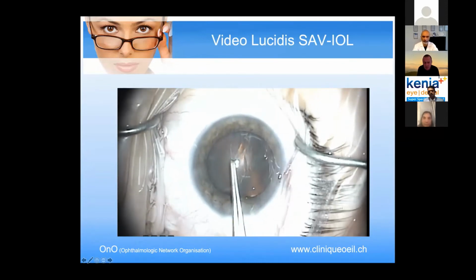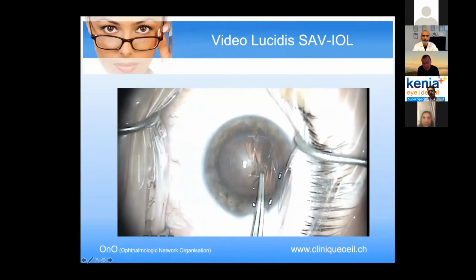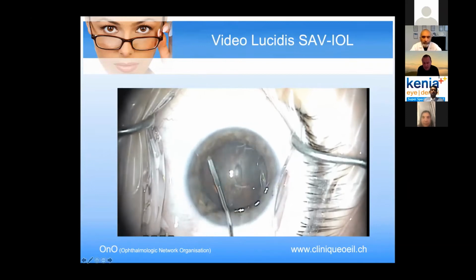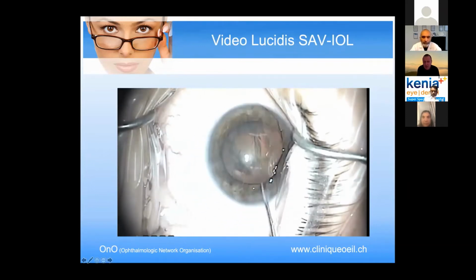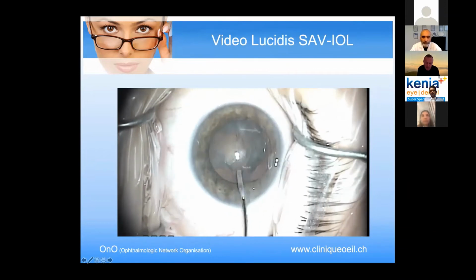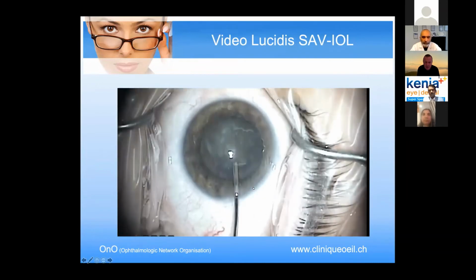We do a capsulorhexis, I always do a little more than 5.0. And I think it's important for the Lucidis to enlarge a little, to have a big capsulorhexis at the beginning. I do the hydrodissection, hydrodelineation.